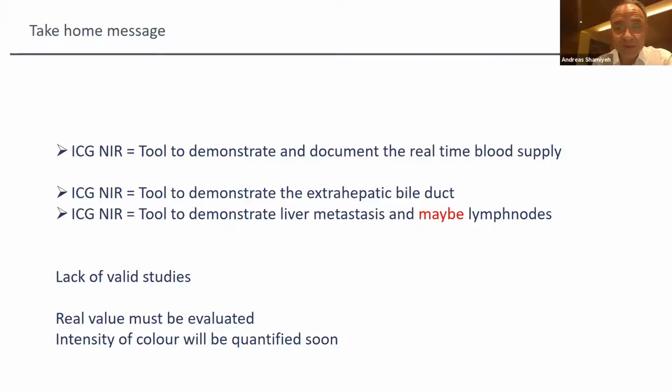as well as the use in colonoscopy. It's on the market available now. Unfortunately, we have it not completely installed. We will start with this at the end of the year, but it works already. We had the demonstration. You can also use this for proving the mucosa using colonoscopy or gastroscopy. This will be the next step.